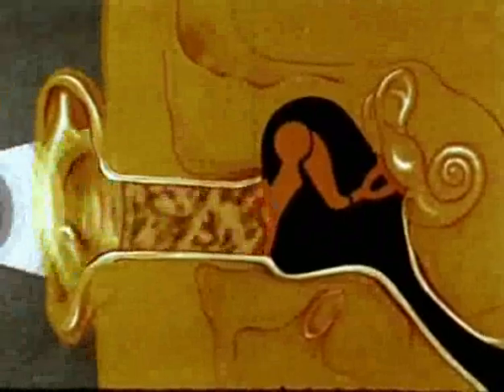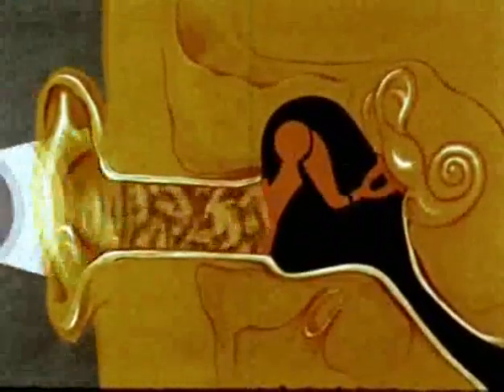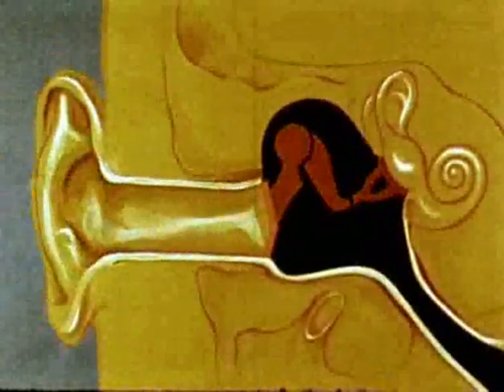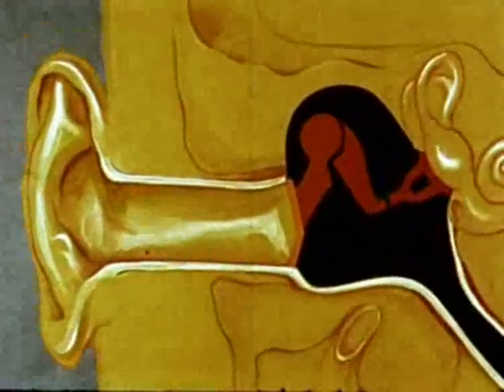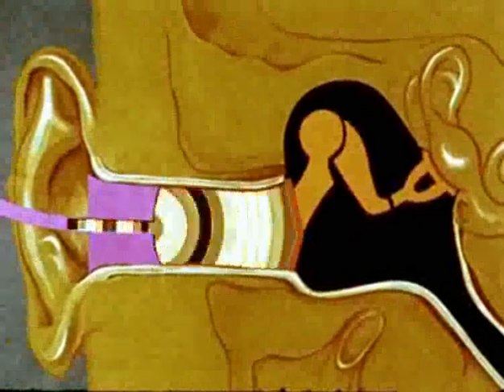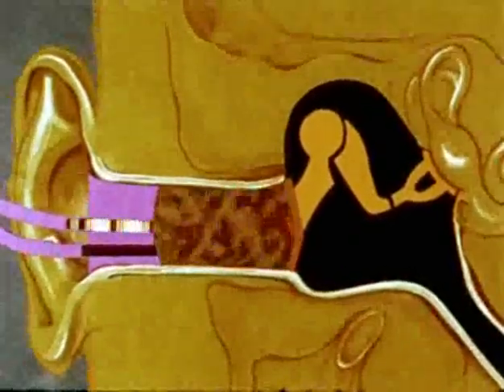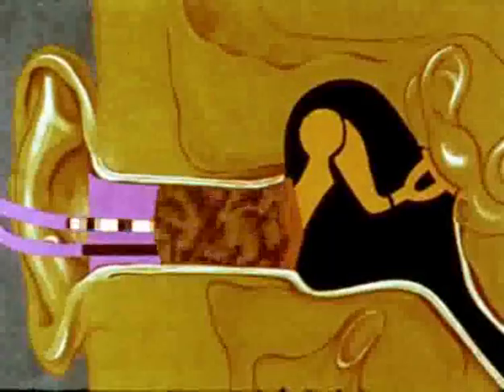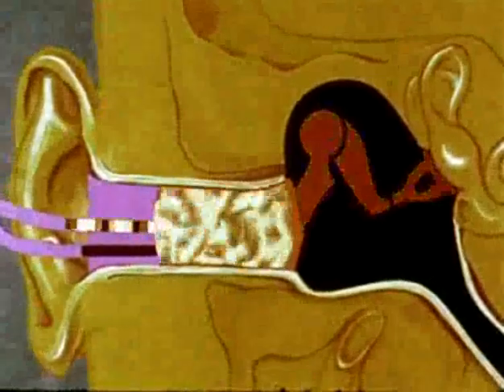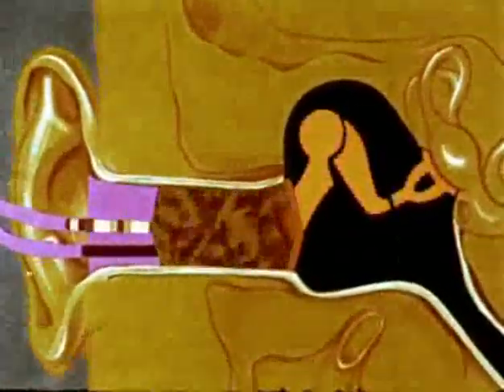It is possible to quantitate the acoustic impedance of the middle ear by measuring the sound pressure level of this residual sound in the external canal. The ear canal is plugged and a sound source introduced. It delivers sound of known intensity. A probe microphone is then introduced to measure the residual sound pressure level within the sealed external canal. If the level is high, it indicates poor absorption by the tympanic membrane. If low, good absorption.